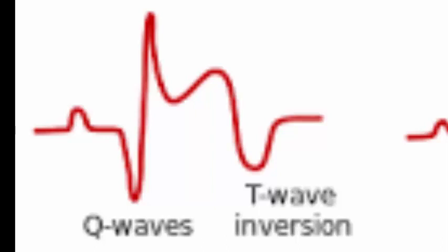The infarcted zone behaves like a neutral window through which the opposite wall is visible. The electrode overlying the infarcted zone picks up depolarization waves on the opposite wall of the left ventricle. The waves in the opposite wall will always be seen moving from the endocardium towards the epicardium. This away movement is picked up as Q waves in the electrodes overlying the infarcted zone.